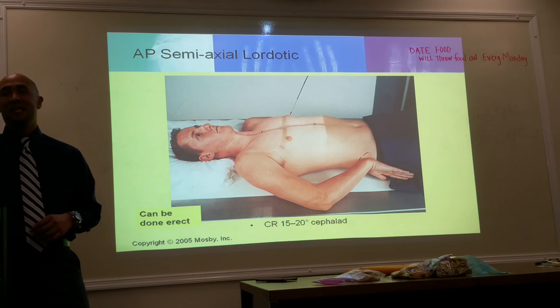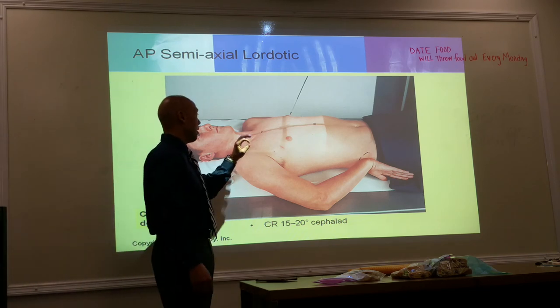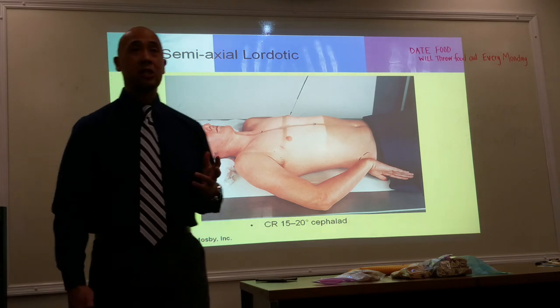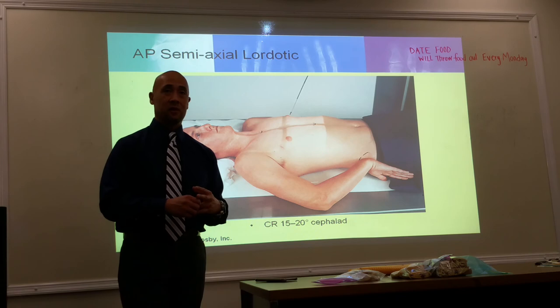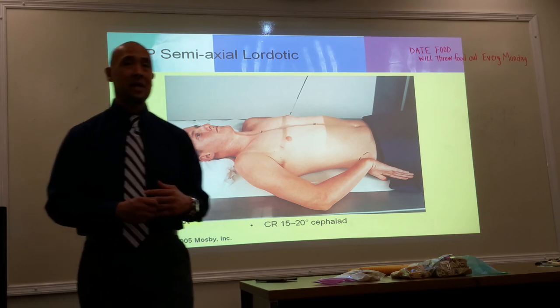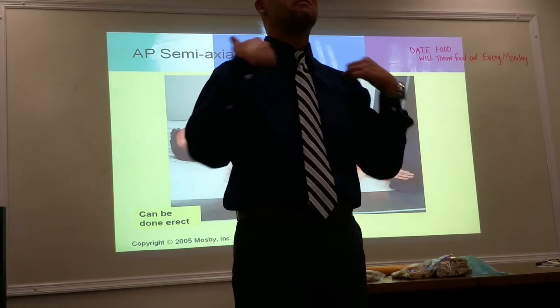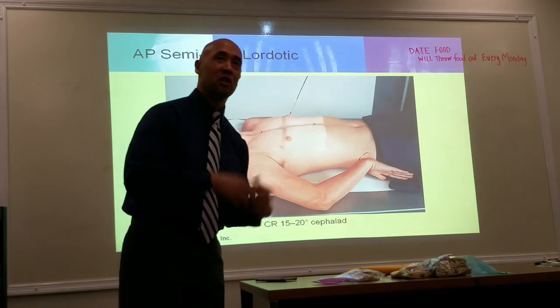Would you shield anything other than gonads there? No. So the question was, should I shield anything other than gonads? Well, if we put the thyroid shield on here, it's not very common to see anybody shielding the thyroids, especially if you're doing a chest x-ray. It just looks uncovered, only because they think it might get in the way of the image, because your thyroid is right at the level where your apices are, and it can get in the way, and then you end up having to do it again.